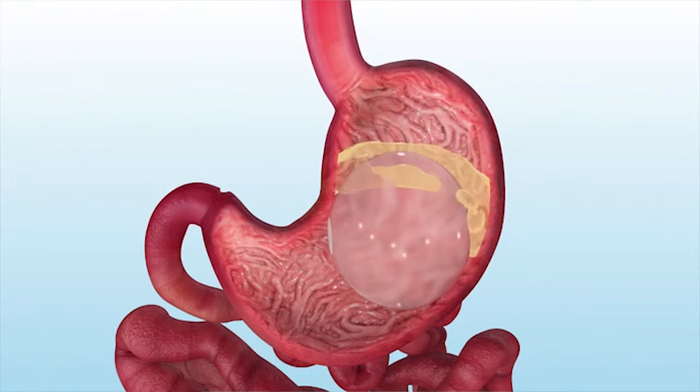The balloon also triggers stomach stretch receptors, slowing stomach emptying and triggering hormones that lead to increased feelings of fullness in between meals.